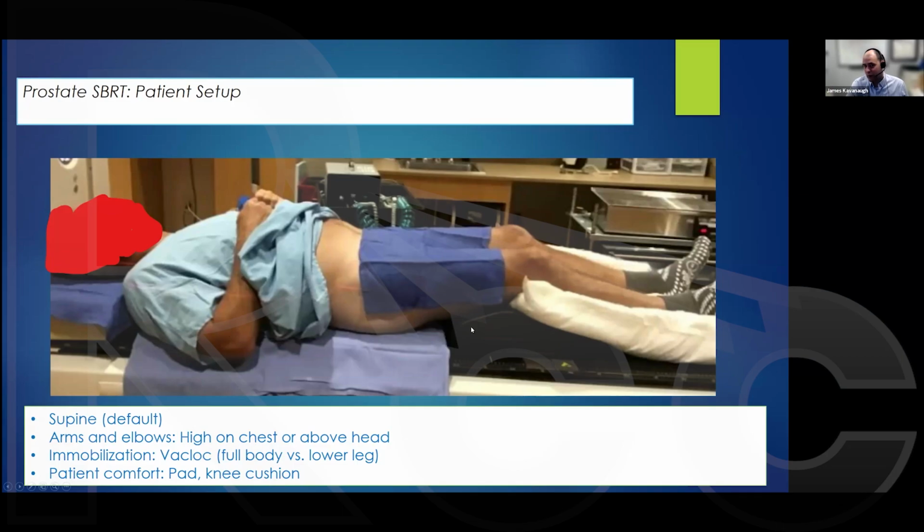And we do that because we found it to be the most consistent and reproducible for the patient. When they have a vac lock bag around their pelvis that we're treating, it kind of makes a bowl that's oddly shaped. And when they lay down, if they're a little bit off, they don't settle into that same exact spot, so we're seeing a lot of variation day to day. But we also didn't want to have a situation where there's nothing in terms of locking them into place. So having it at the knees, having it at the head really, really helped. And obviously then marking the patient and making sure they're aligned in like a 3-point landing we found to be by far the most consistent.